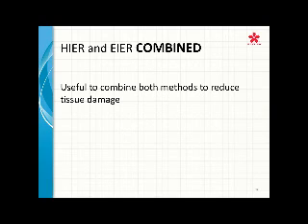Going back to the enzyme, just so you can correlate that with what you're using in your clinical laboratory, what I mostly see when I'm performing immunohistochemistry is that your enzyme will be labeled as a protease. So if you're using any reagents on your carousel or in your automated system and you see something that says protease, that's the actual enzyme that you're using to retrieve your epitope.